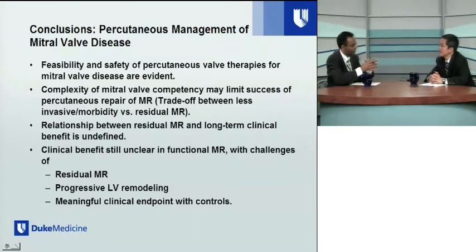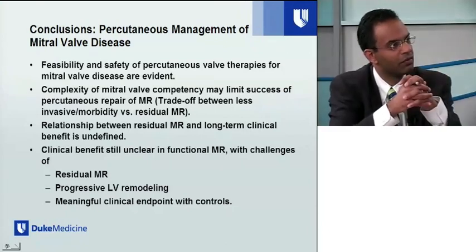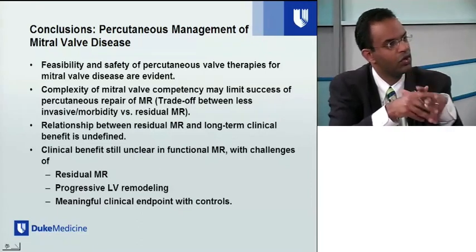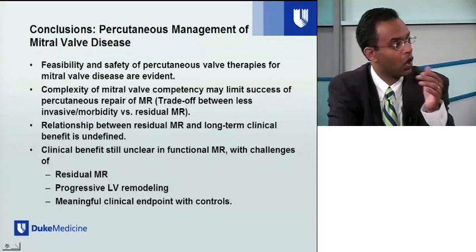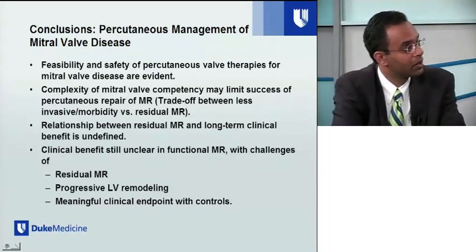You know, we've talked a lot about reduction in residual MR, and that's probably an appropriate endpoint for some of these early stage studies. But I want to ask you, is that just a surrogate? Is that something that we're going to come to view like we do with blood pressure and antihypertensive therapies? In your opinion, what should we be looking at? It seems like from the EVEREST data, the long-term clinical outcomes of heart failure and quality of life seem pretty promising. Right.